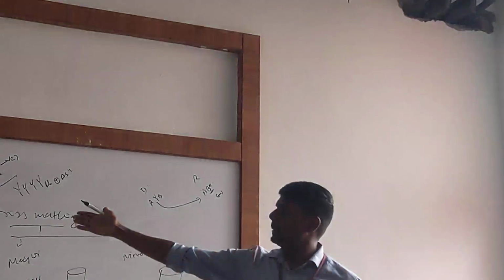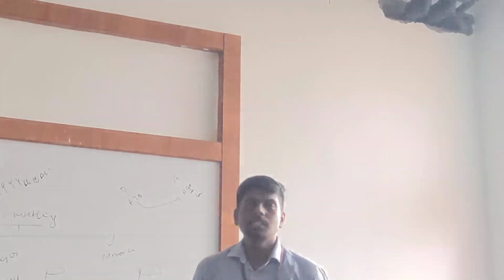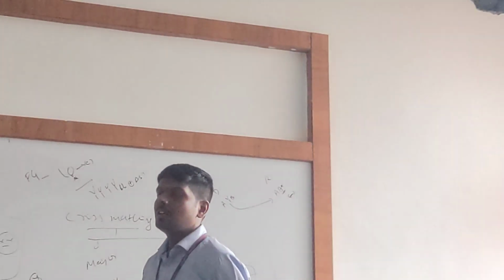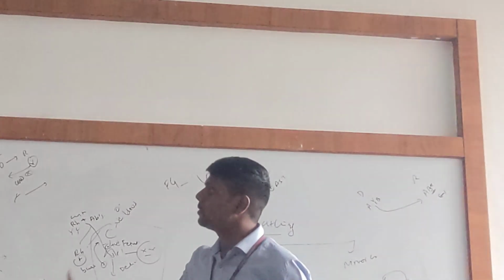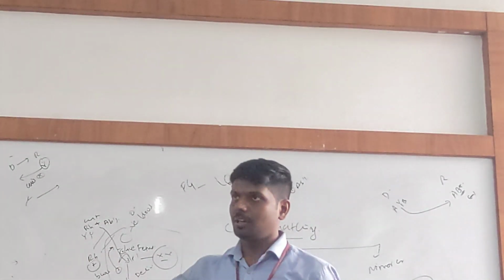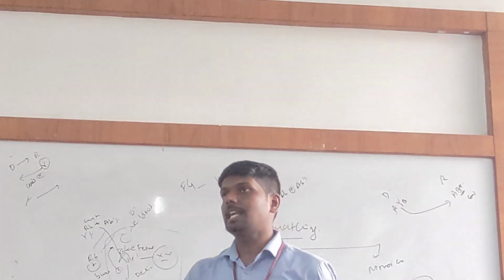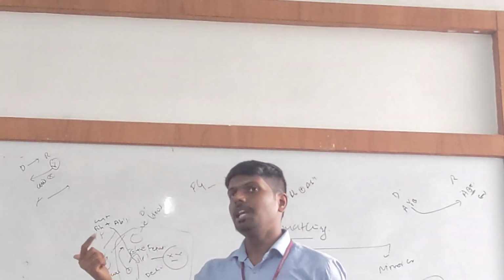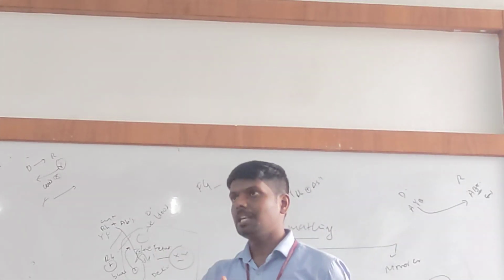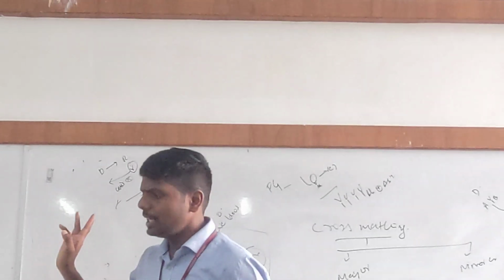One classical example is erythroblastosis fetalis woman. She is an O-negative pregnant woman. We thought she is an O group in forward grouping, and we went for transfusion. Unfortunately, she is having sensitization. So we did transfusion of O positive cells, and they reacted. Now, that is one example.